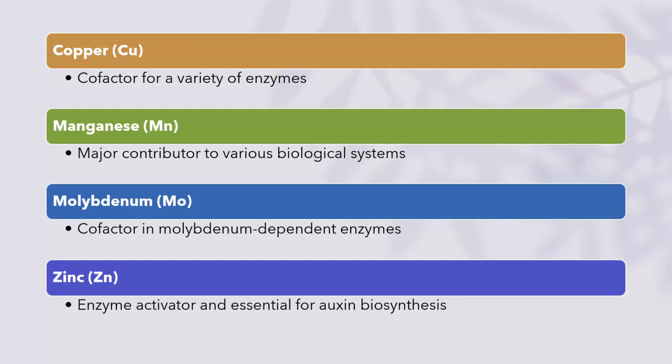As a cofactor, manganese is required by some enzyme reactions, particularly in photosynthesis, respiration, and nitrogen assimilation. Manganese is also involved in pollen germination, pollen tube growth, and root cell elongation. Usually, manganese is added to the medium in the form of manganese sulfate.